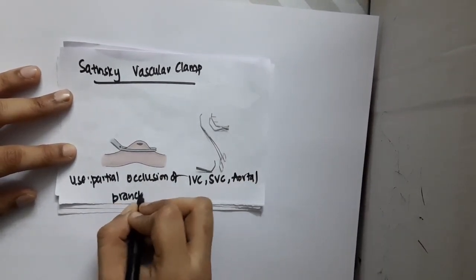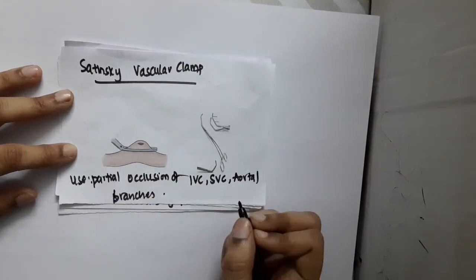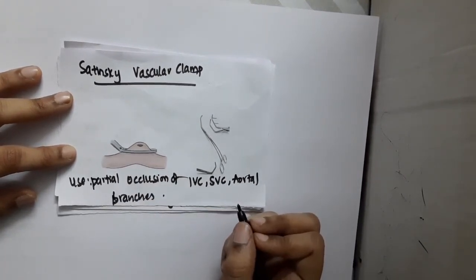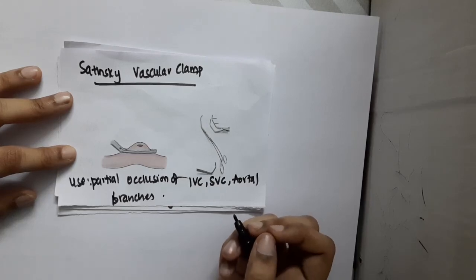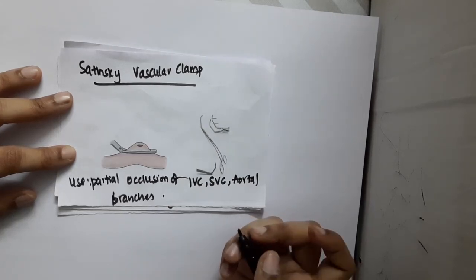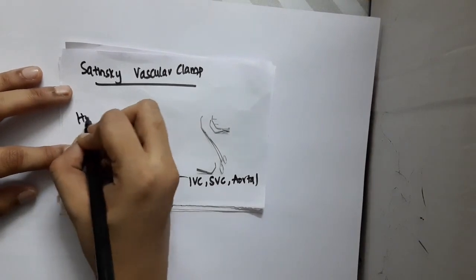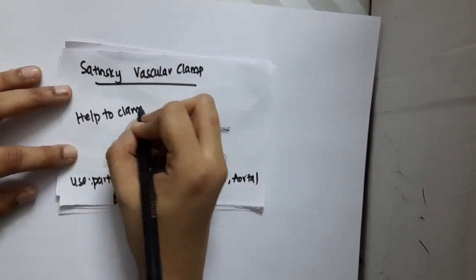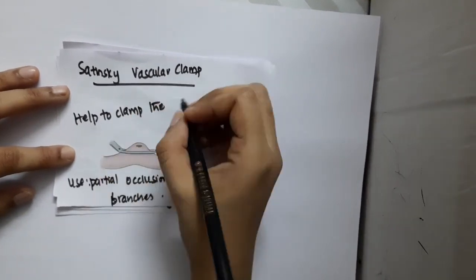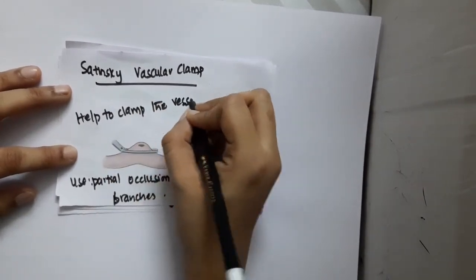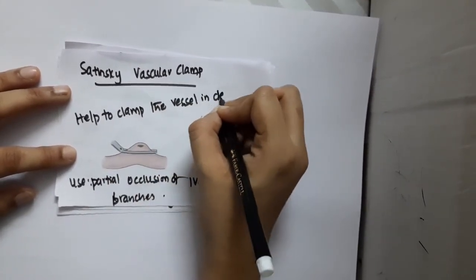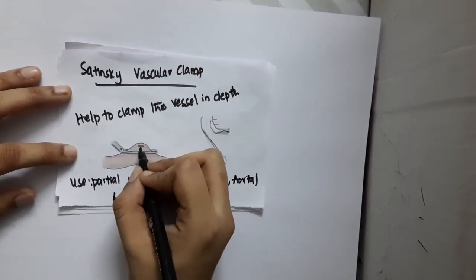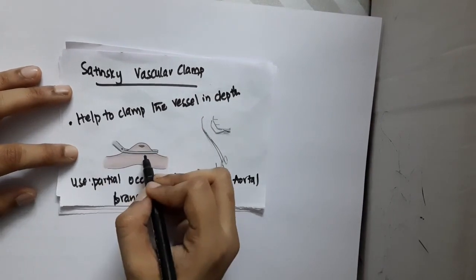This is the Satinsky vascular clamp. The main advantage is it helps clamp vessels at depth. When the vessel is deeper, we can clamp like this so the surgeon's view is not occluded.